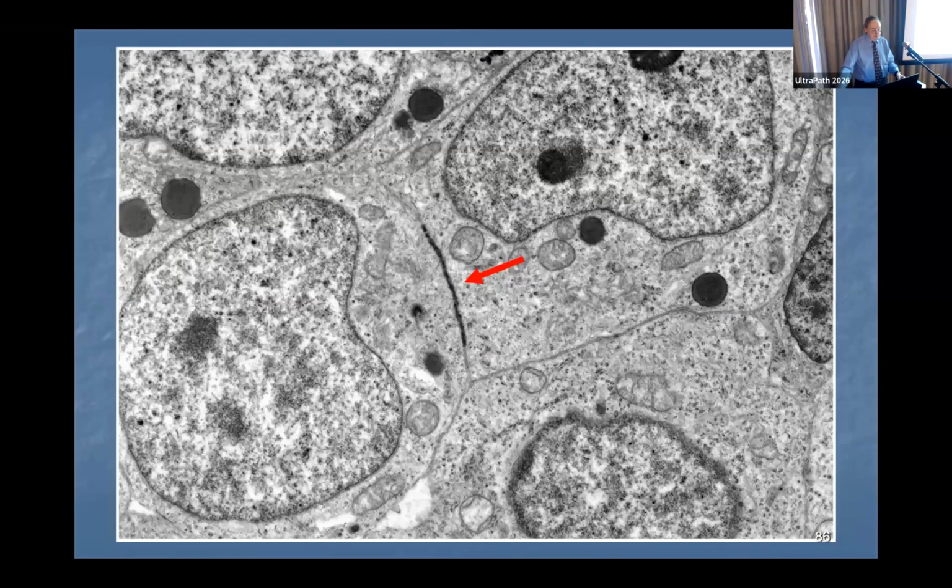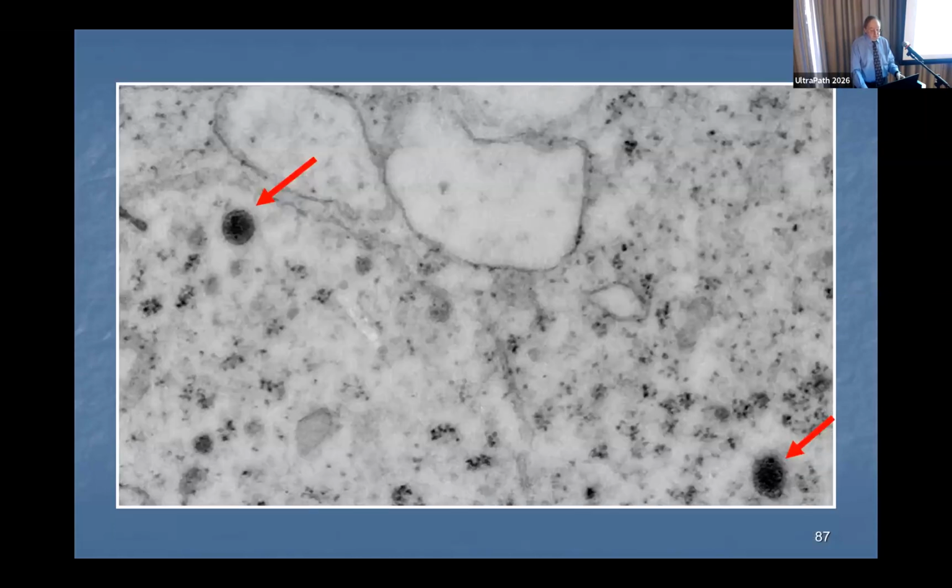Cytoplasm usually doesn't have much of anything in it. Here we can see that it fits into a solid tumor component because it has an intercellular type of attachment. In the background, you can see that there's really not much of anything located within these cells at all. And this is the undifferentiated appearance that you often see in the basic form of Ewing sarcoma.